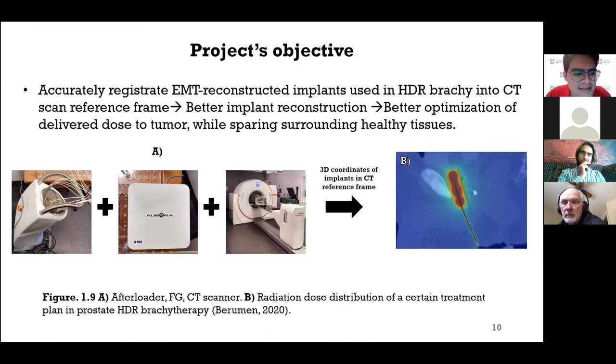For the clinical setting, I don't know much about that. But I think I've read that it's like 30 minutes. I think it will take more, with all the preparation, because before inserting the radiation, they have to do a planning, taking the images in the CT with the catheters inserted, and then they do the planning with this information. But the exact time I don't know.